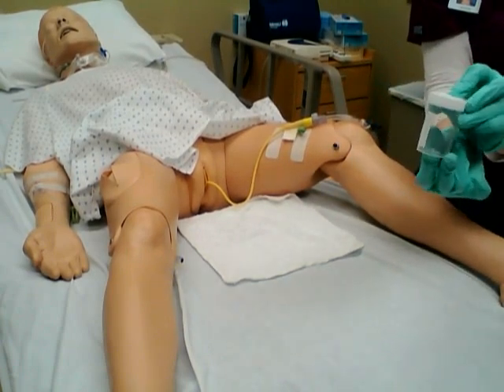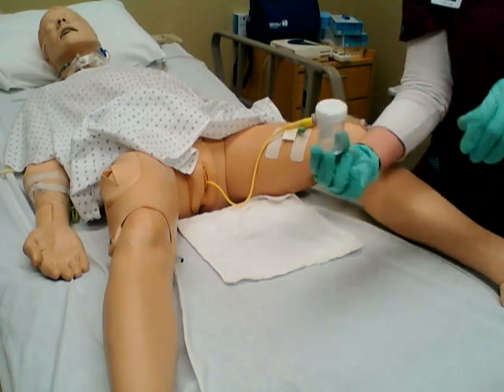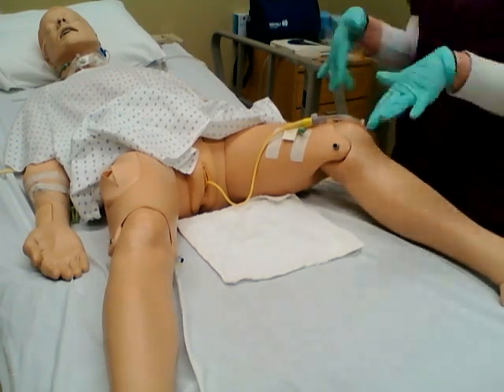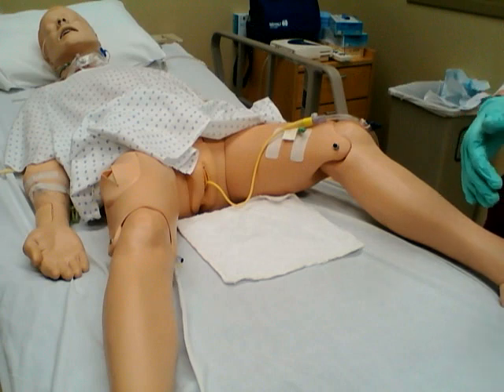I still have this, which came out of my catheter pack earlier. When I take the cap off, I want to make sure that I remove that cap lid and keep it down. I don't want to contaminate anything, and I also would have put on new gloves and washed my hands after the last procedure. Now the patient is ready.